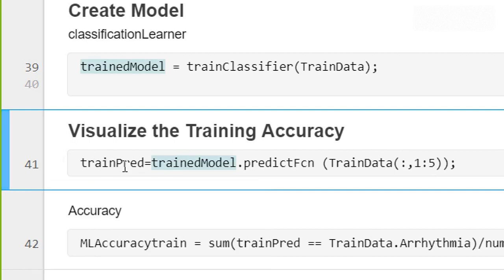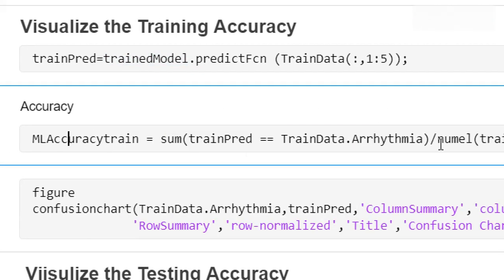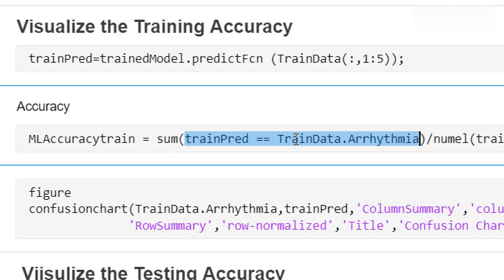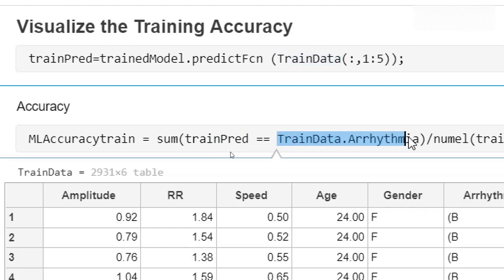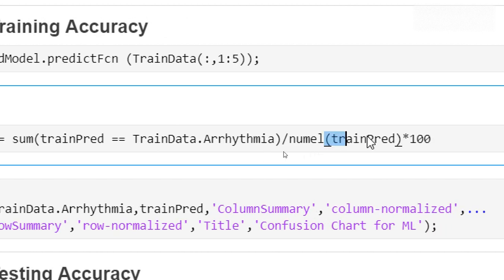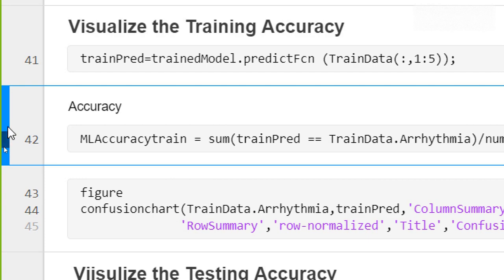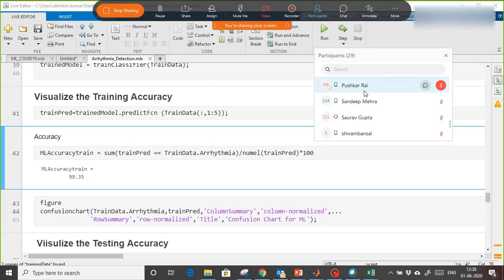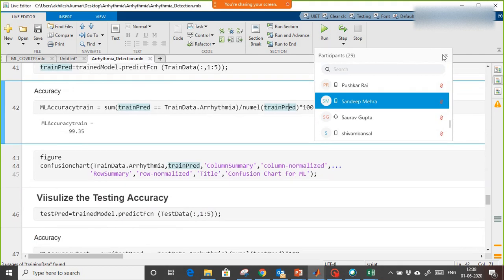To calculate accuracy, wherever the predicted output matches the original arrhythmia label in the training data, a value of one is assigned. Summing these and dividing by the total number of samples using numel, then multiplying by 100, gives accuracy in percentage. The training accuracy is effectively 100 percent, and testing accuracy is 99.35 percent.